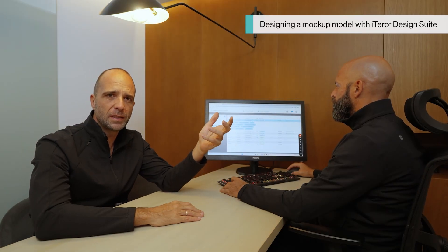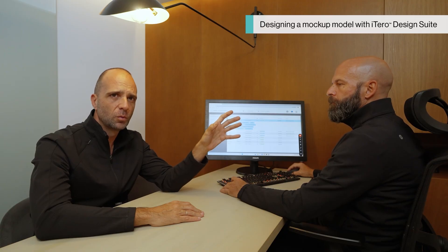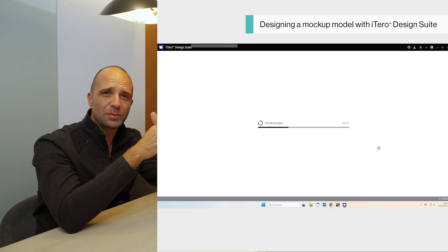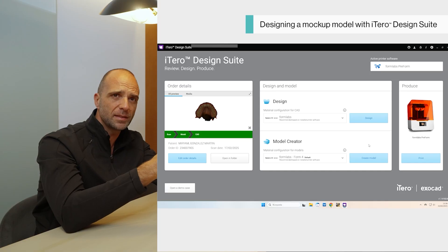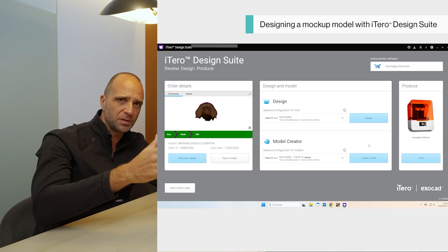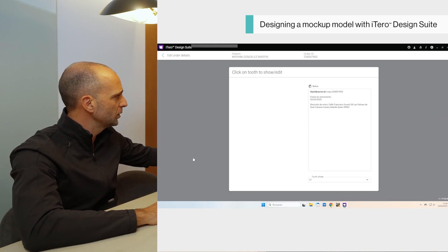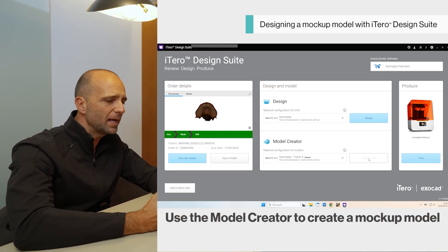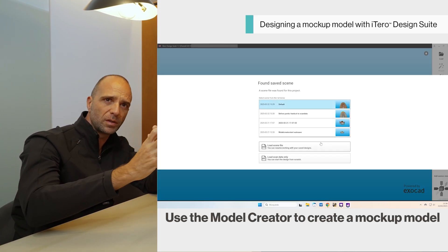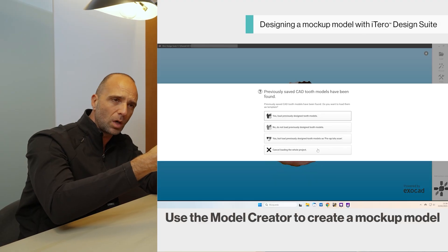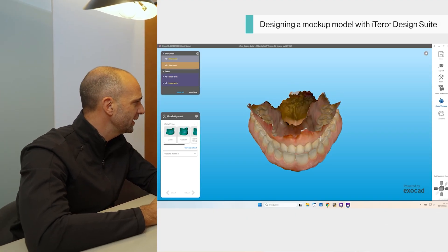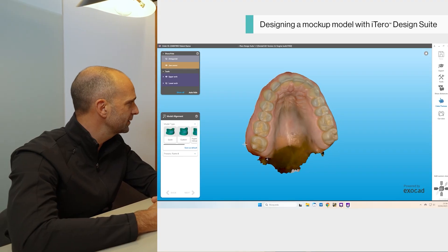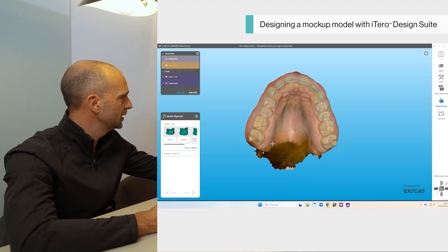Now that we have shown how to do a mock-up with the clip-on version, we will show the second option — the model option. We will enter into iTero Design Suite again and design a physical model to be printed, then use a silicon index to transfer this information into the patient's mouth. We check that the order details are correct, and we go into the model creator. The model creator opens the design phase to connect the model with your design and make it physical in one part. We put the digital wax-up ready to be integrated.